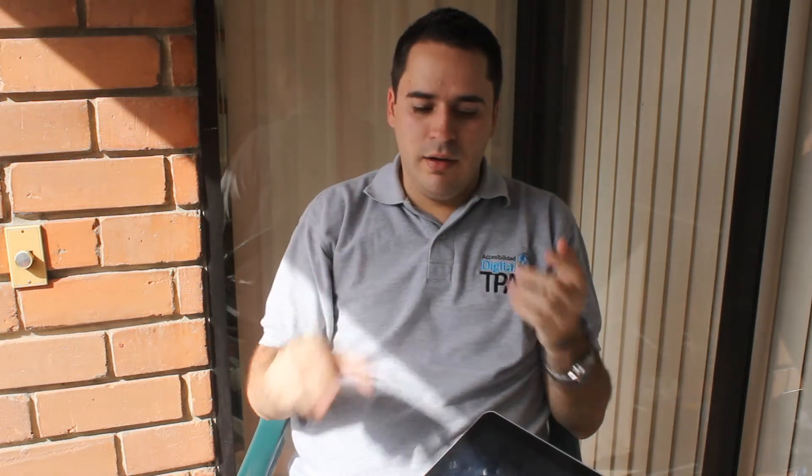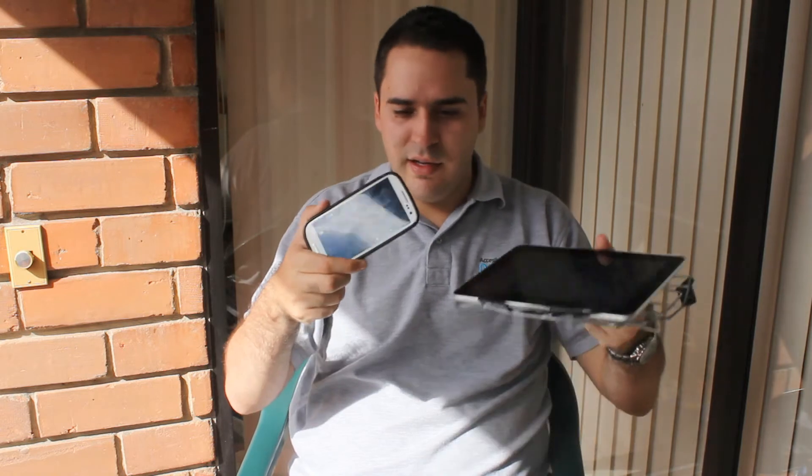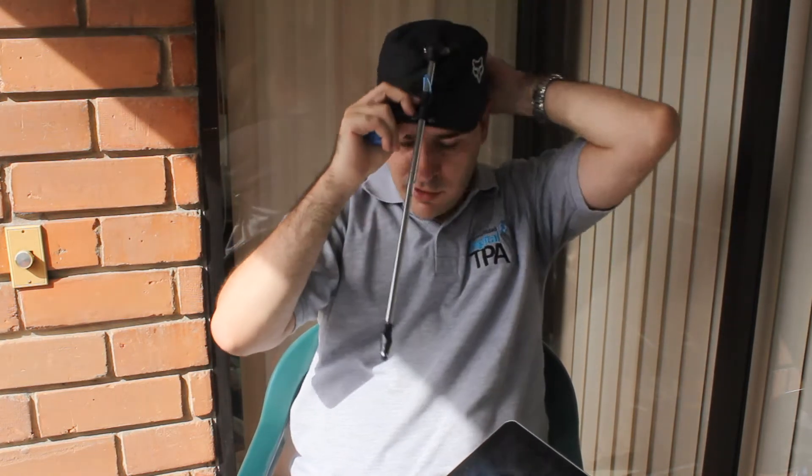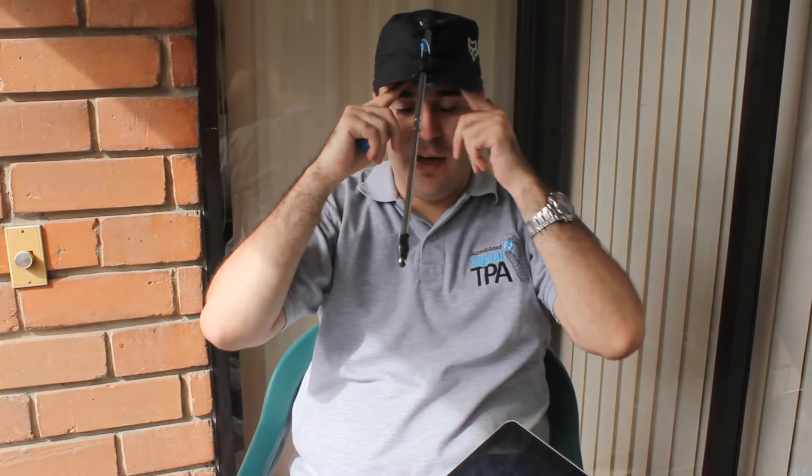So, how can a person that can only move their head use a touch device like a tablet or a smartphone? Here is the solution. This is a stick — they put it on their head and they can use it. The question you will ask is: how can they transmit the energy that you use with the finger if they are not touching?